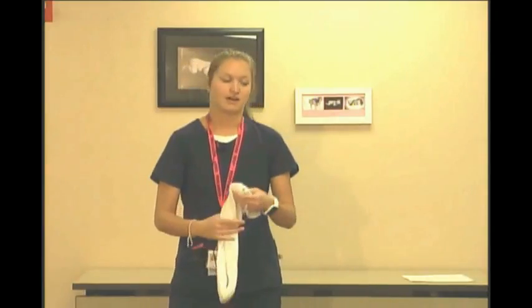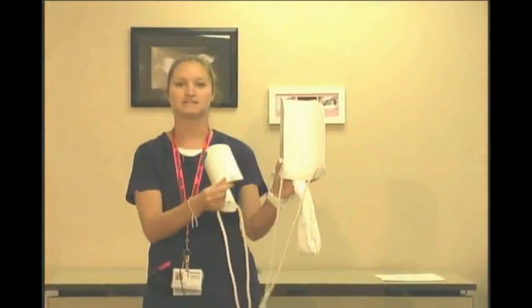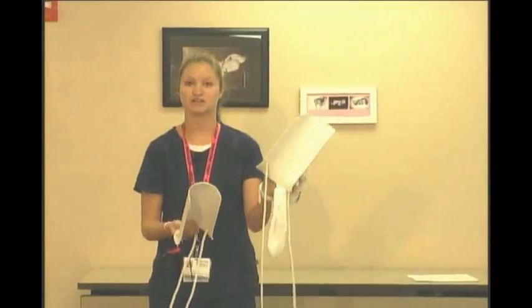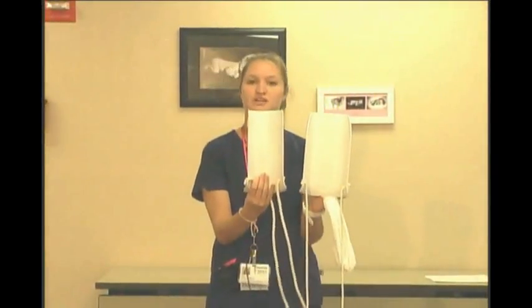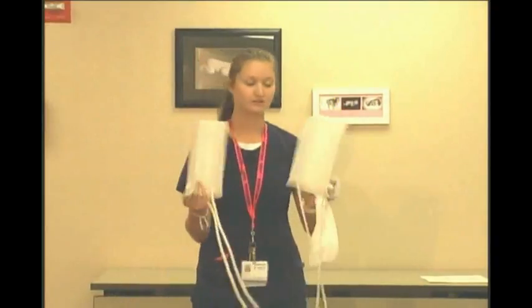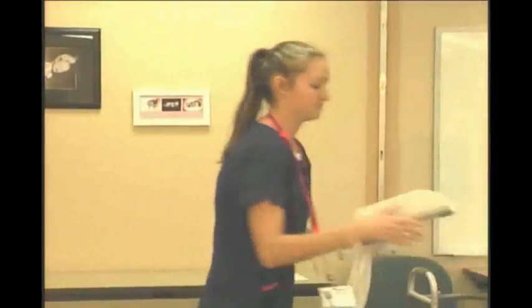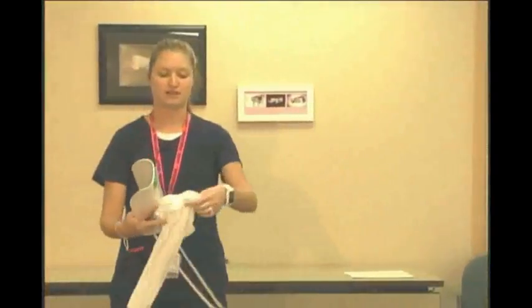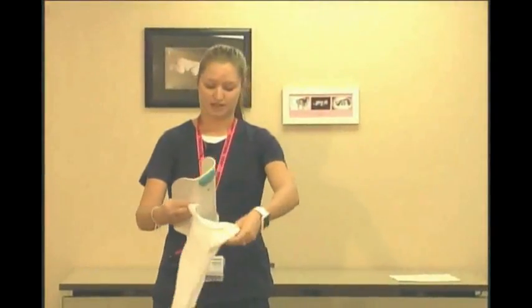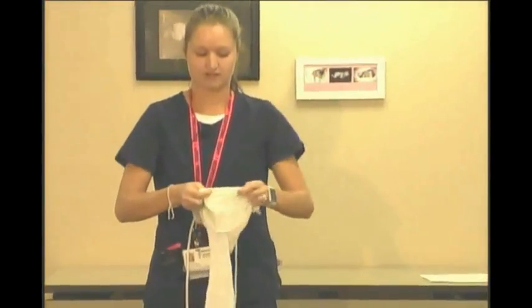Another way to get them on is with a sock aid. There are 2 different sizes that we use. This is a wide square. Men typically use this one. They're a little bit bigger, allowing for more room. And this is a regular size. Women typically tend to prefer this, but we have had it where it flip-flops, and men prefer this one. So what you're going to do, if you do have a sock aid, you'll match up the top with the top and the bottom with the bottom. You'll put this on like so.